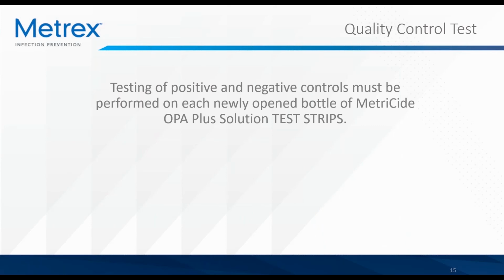Now we'll talk about the quality control test. Quality control tests are required each time a new bottle of test strips is opened. This will involve creating a positive control and a negative control and essentially testing the test strips. And we'll go over the step-by-step instructions in just a moment.